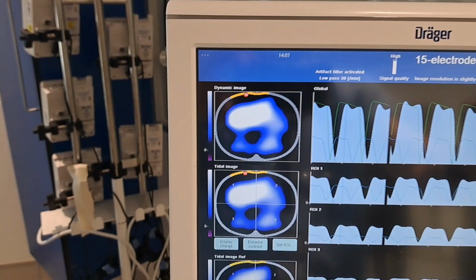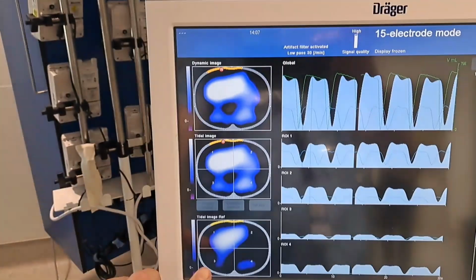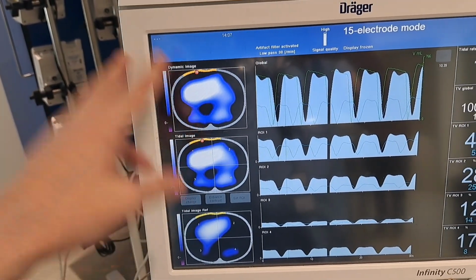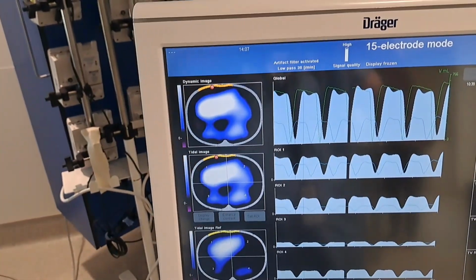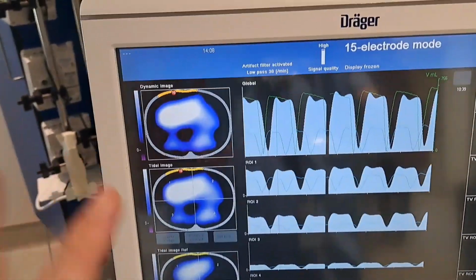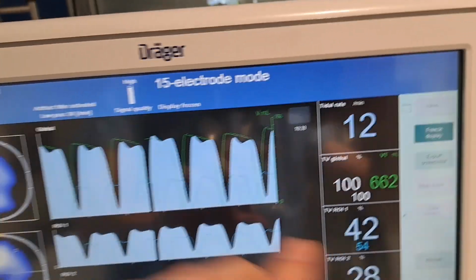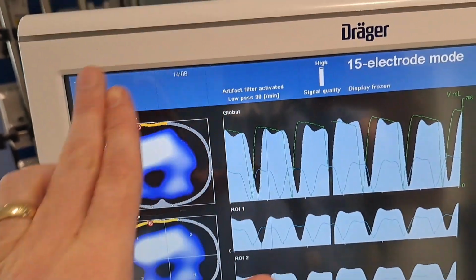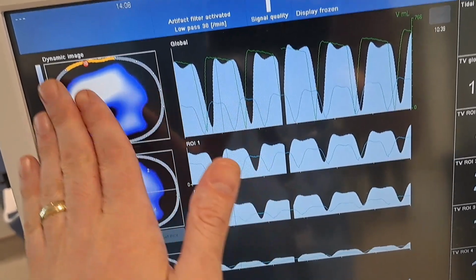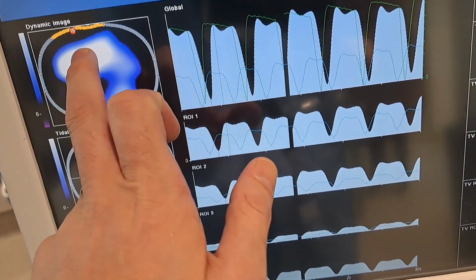But yeah, I think we've come a long way from here. This was done almost recovery within 15 minutes, and it's gradually improving. The white that is within the blue, all it's telling you is that there is, of the tidal volume, more, the majority. It tells me that a lot of volume is going here. All the blue is tidal volume. That's distributed, but there's also more here.